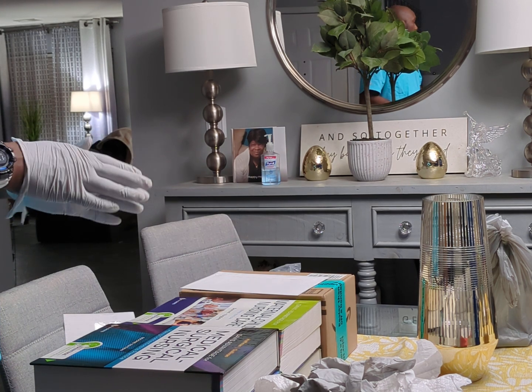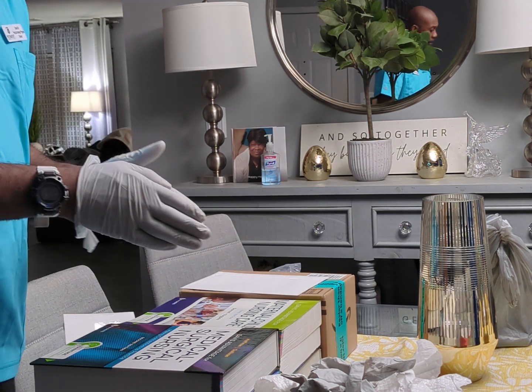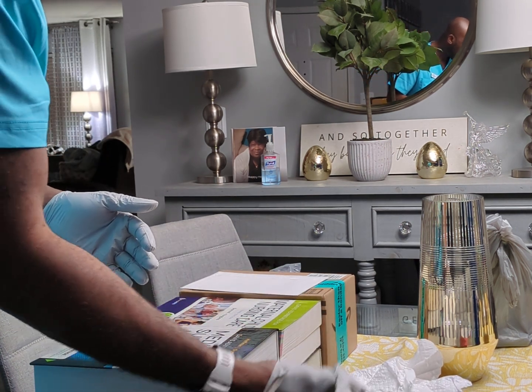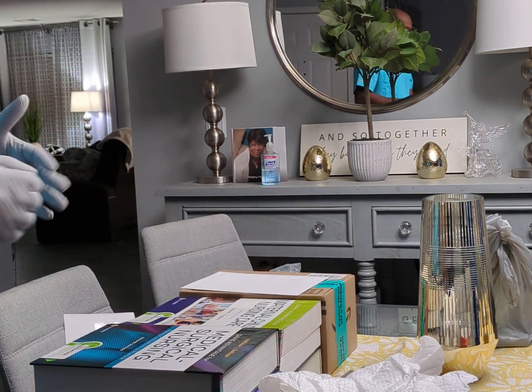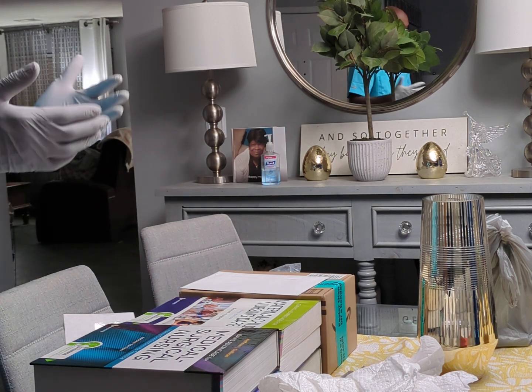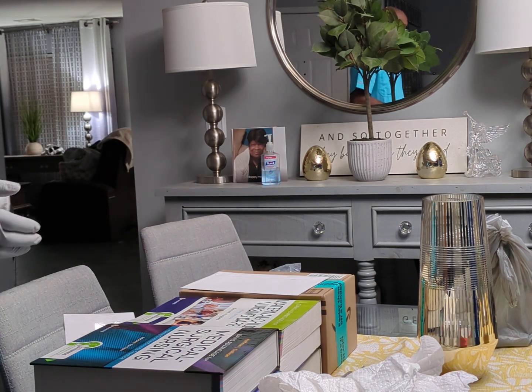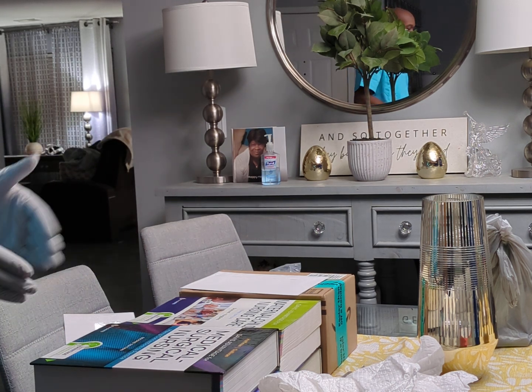I'm going to set up my sterile field, and I'm going to open up my dressing package. Because everything is inside my dressing package, I'm just going to talk this through, because this is going to be my space that I use, and also this is going to be my patient at the same time. But I'll tell you when I erase the patient, okay? Just because I don't have that much space.